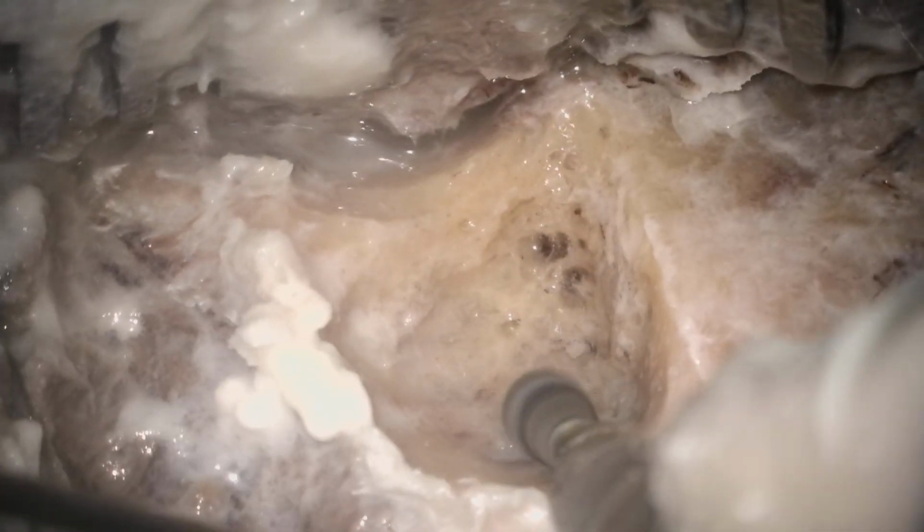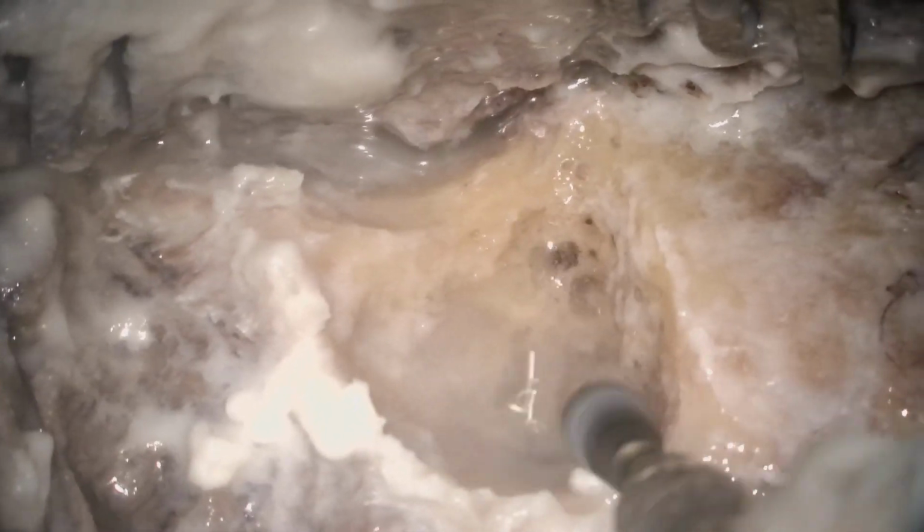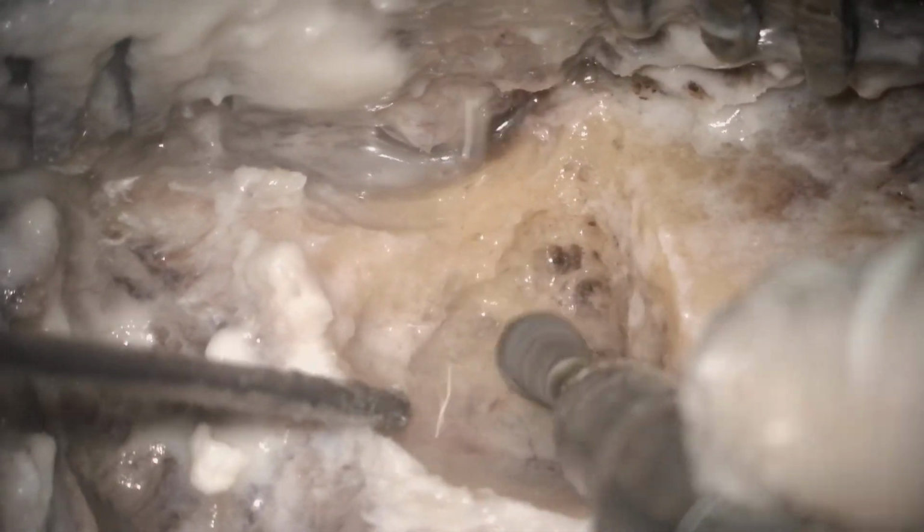You can see the pink color of the tegmen tympani or tegmen antri, the sigmoid sinus with a bluish tinge, and the jugular bulb will be the same. So all the landmarks and their color change will be very prominent in live surgery, but it is not actually very evident in temporal bone dissection.